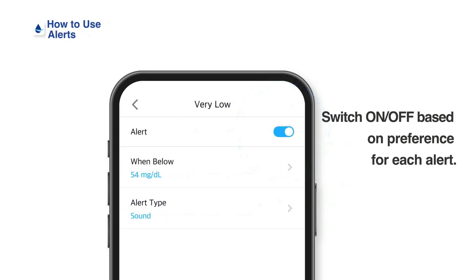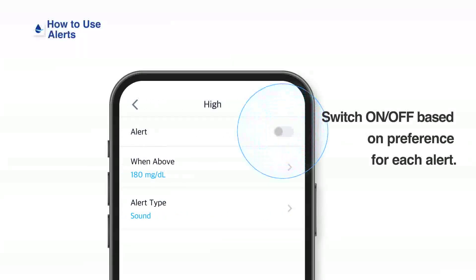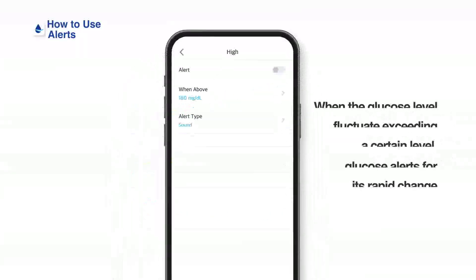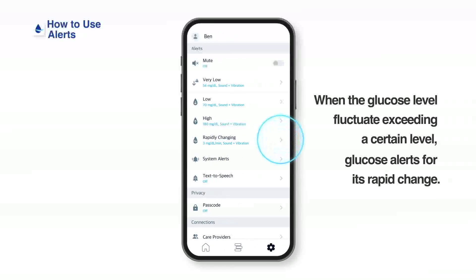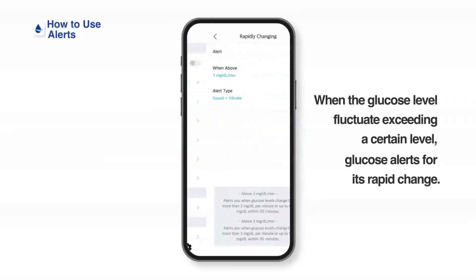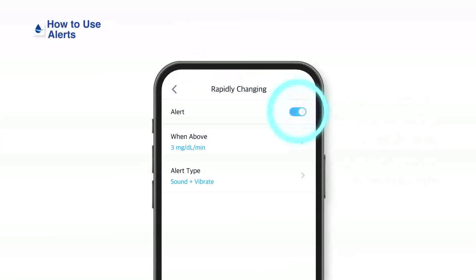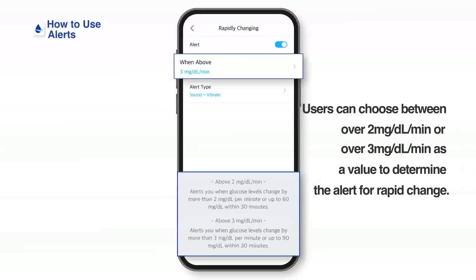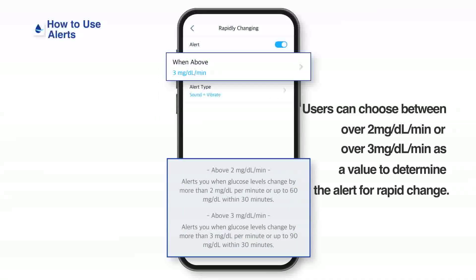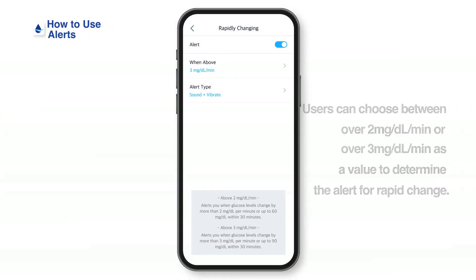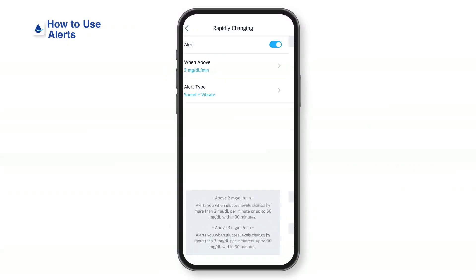Switch each alert on or off based on your preference. When the glucose level fluctuates exceeding a certain level, a glucose alert triggers for its rapid change. You can choose between over 2 mg per deciliter per minute or over 3 mg per deciliter per minute as a value to determine the alert for rapid change.